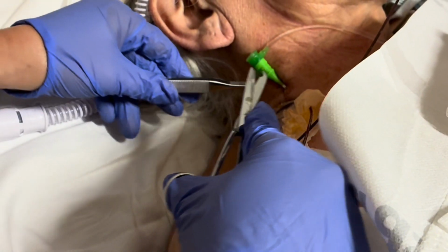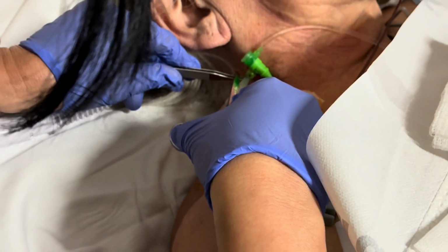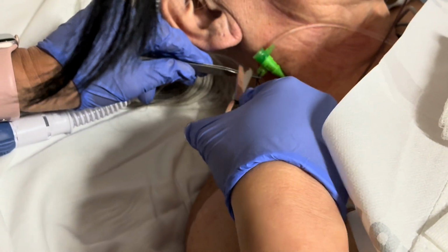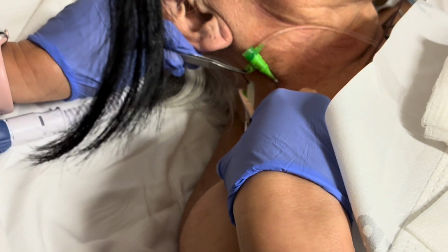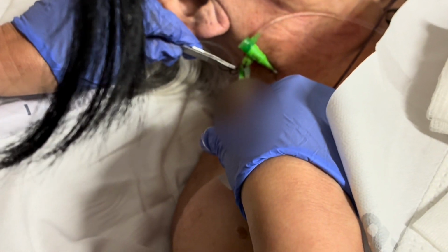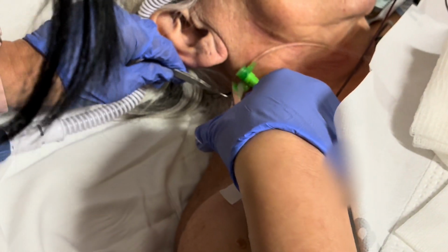Okay, so let me use this. Can we raise the bed up a little bit so we don't have to stoop? Is that fair enough? Yeah. Or do you want it up? You need light? All right, no.